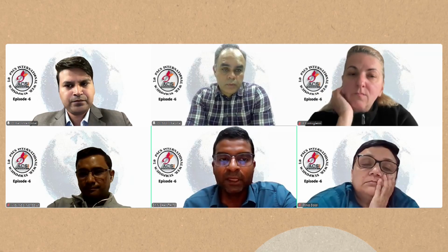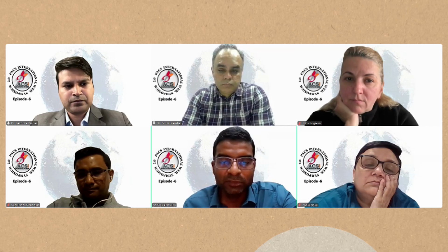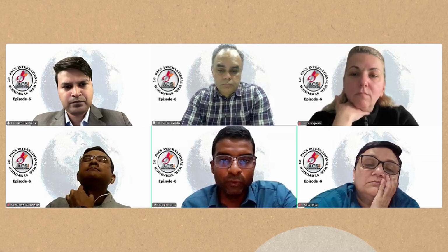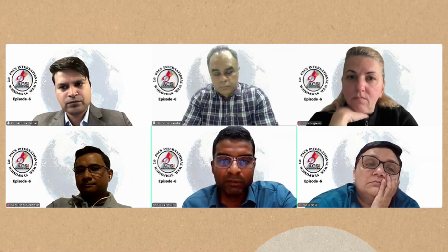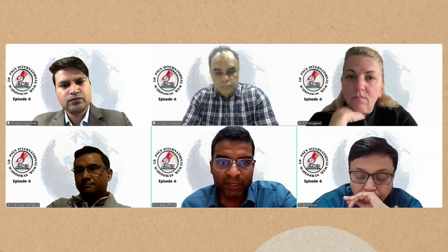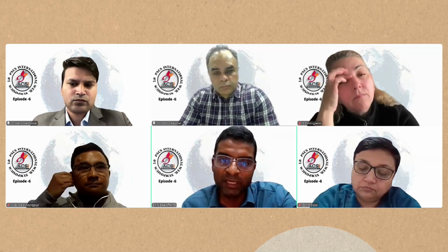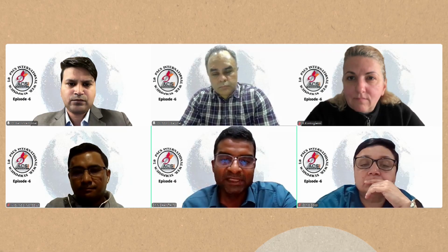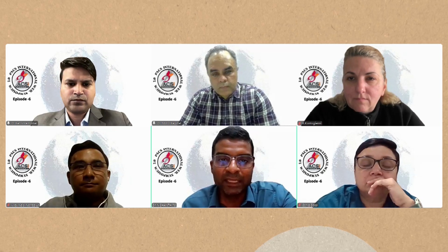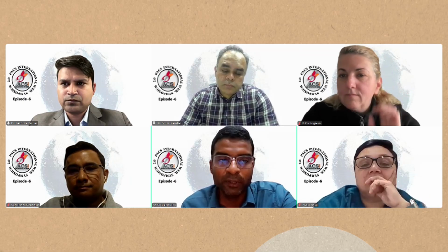And also, when you are having a massive bleed, with our flexible bronchoscope it will be only a reddish view you will be seeing, only blood. So you should have a rigid bronchoscope at your side, because you are dealing with the airway, and at any point of time you should be able to secure the airway. Or at least you can have a second operator at your side, who, while you are working with your main scope, can have another bronchoscope inside so that you can view what is happening. Otherwise you will be totally losing your field of view.